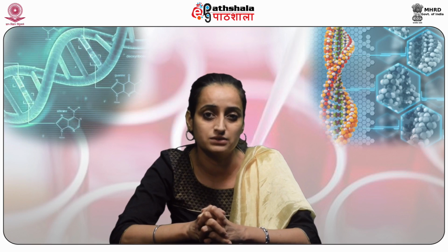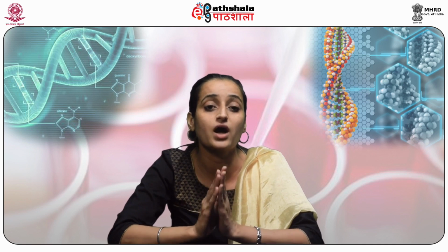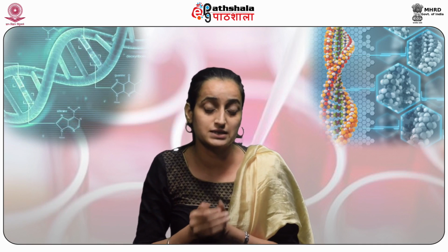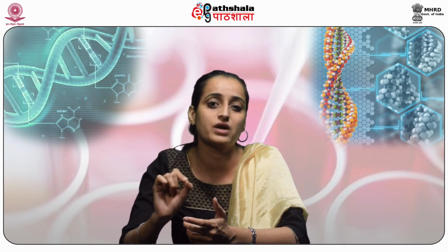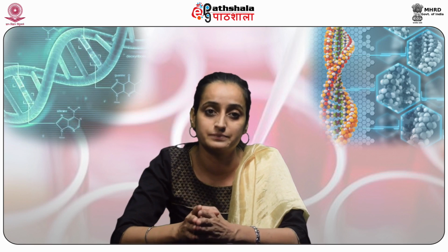The technique was invented by George G. Gall. In-situ hybridization, or ISH, is based on the complementary base pairing of labeled cDNA or RNA probe to normal or abnormal nucleic acid sequences in chromosomes, cells, or tissues, mostly to detect and localize specific mRNA sequences within preserved tissues and cells. Furthermore, morphological identification is possible in a heterogeneous cell population. That is, from such a heterogeneous population, the actual affected cell can be identified.